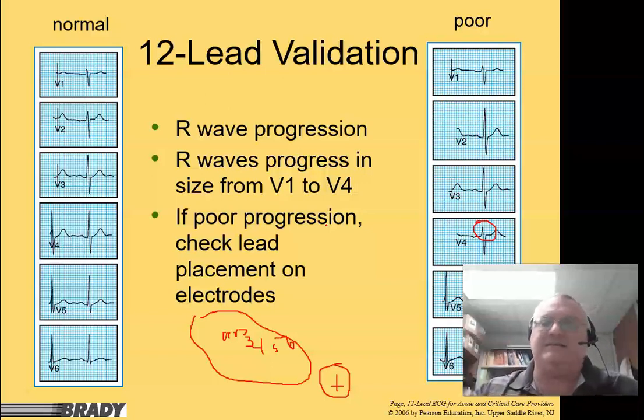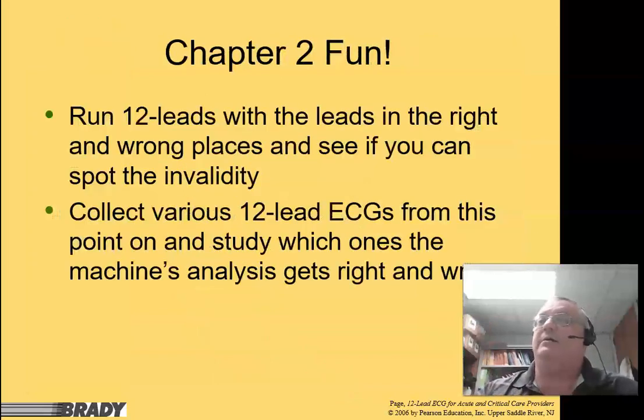As dumb as it sounds, one of the first things I do when I'm telling somebody to troubleshoot a computer is ask, hey, did you turn the power on? As dumb as it sounds, it is very much true. So the first thing I tell students when they're checking a 12 lead is, did you put the leads on right? Okay. If I'm not seeing a good progression, I'm going, wait a minute.